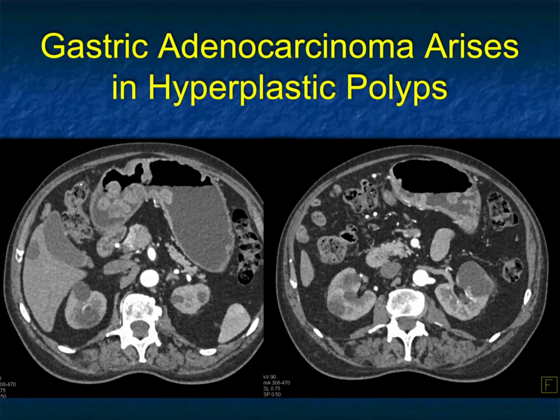You can have hyperplastic polyps — we see them not uncommonly in the stomach. There's always the concern: can they be malignant? Remember certain syndromes — juvenile polyposis has multiple polyps. In this case these were hyperplastic polyps, but if you look at them carefully, particularly in the antrum, they're getting large and look lobular, and they have to be concerning.